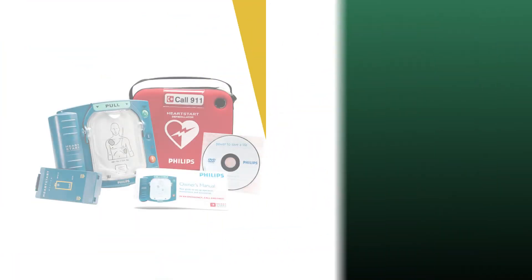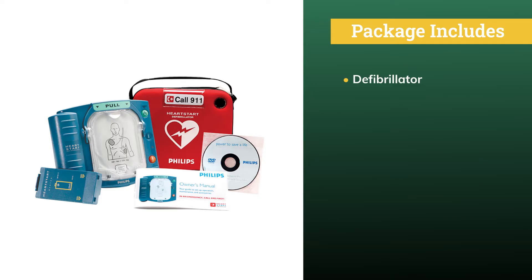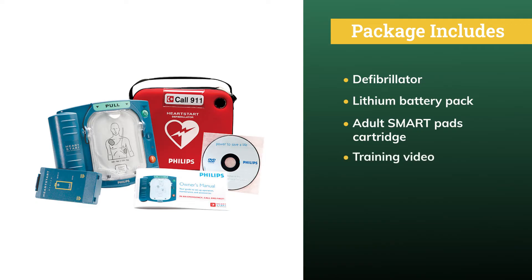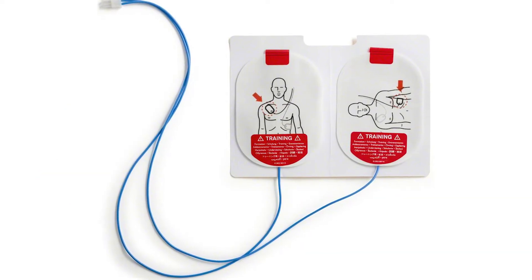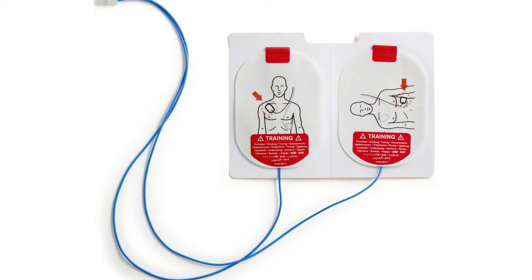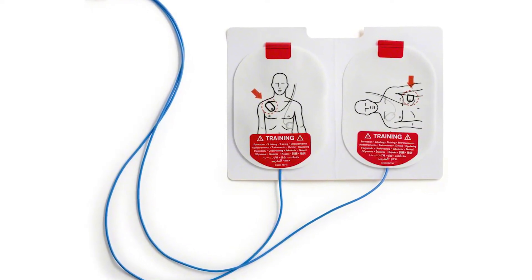The HeartStart Home AED is conveniently available without a prescription. The package includes the defibrillator, a lithium battery pack, an adult SmartPads cartridge, a training video, a quick reference guide, and an envelope containing the owner's manual and other useful information. Training pads can also be installed in the device that disable the unit's ability to deploy a shock so that users can safely practice using the device.